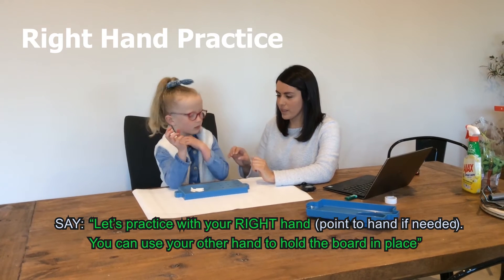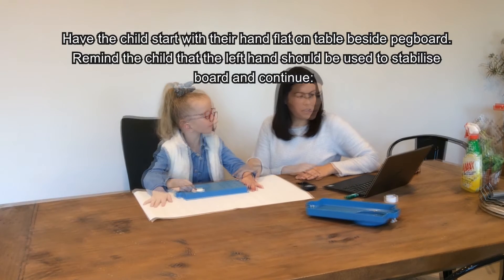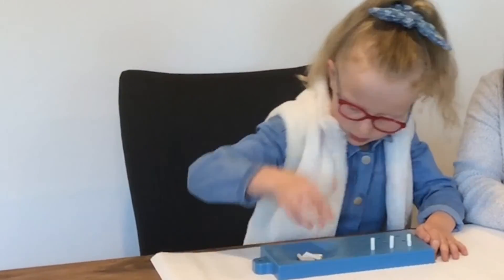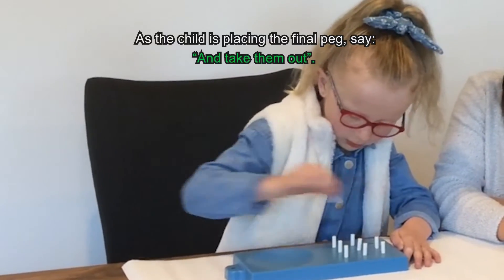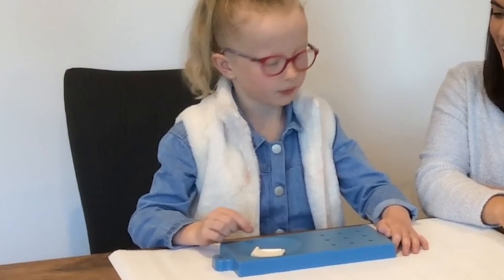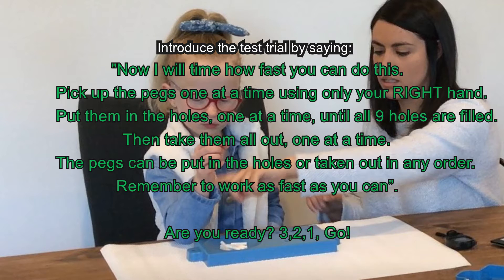Let's practice with your right hand. You can use your other hand to hold the board in place. Are you ready? Three, two, one, go! Now take them out.